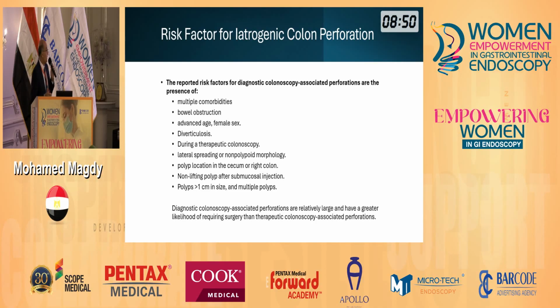Of course, risk factors, like in any procedure: if the patient has multiple comorbidities, bowel obstruction, advanced age, or diverticulum, therapeutic colonoscopy has more risk of complication or perforation.